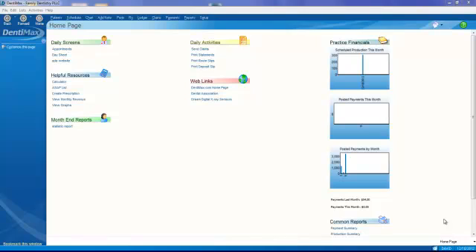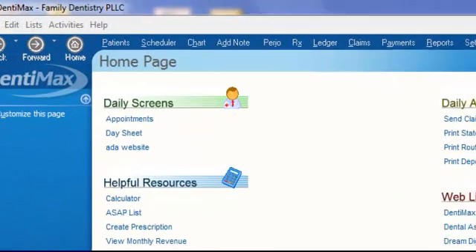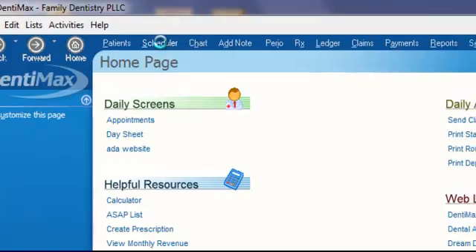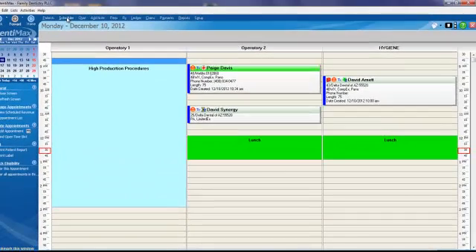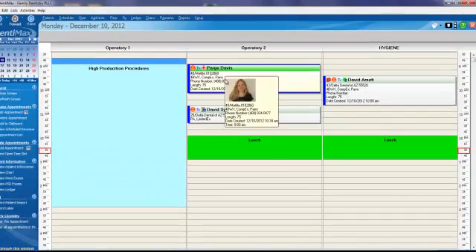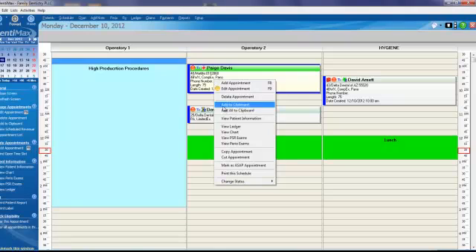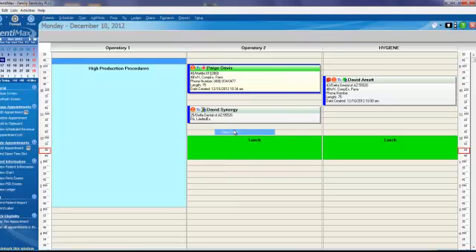The first thing I'd like to show you today is how easy it is to access your digital x-rays from within the charting screen in Dentimax. Let's zoom over to the appointment book. We'll click on Scheduler, right-click on Paige Davis' appointment, and go down to View Chart.